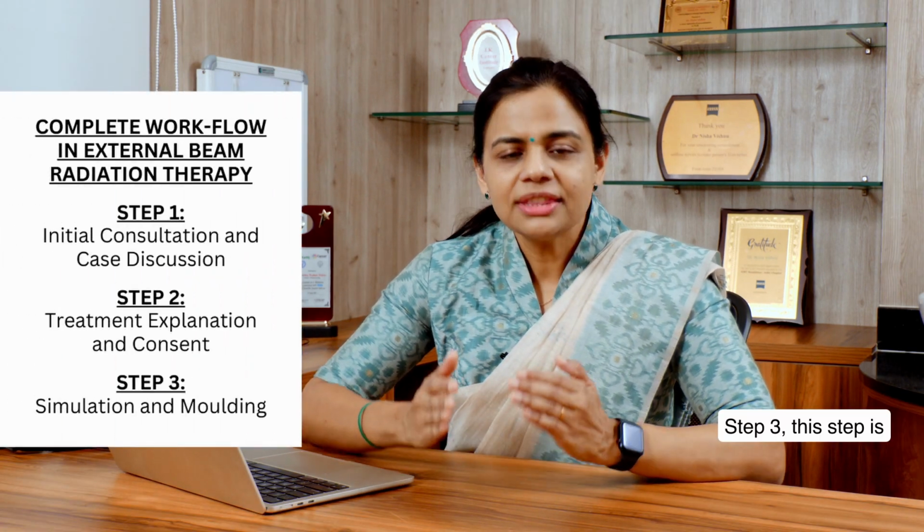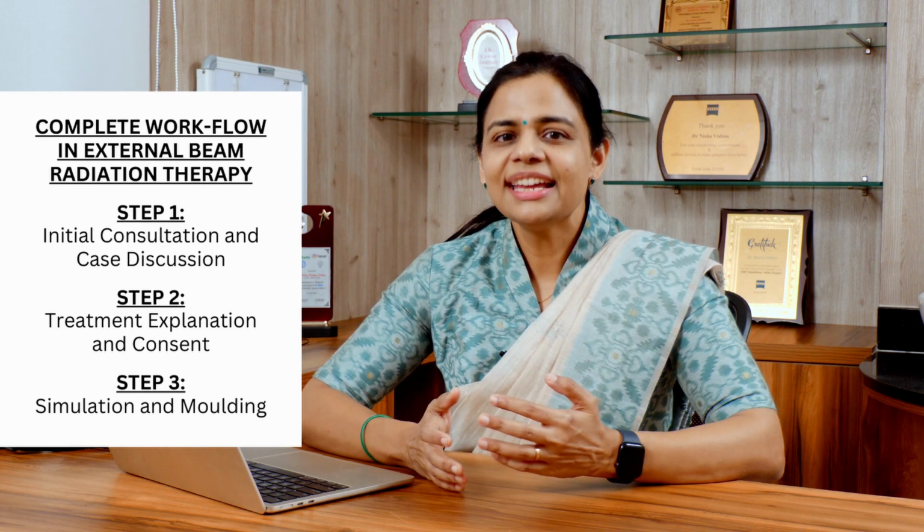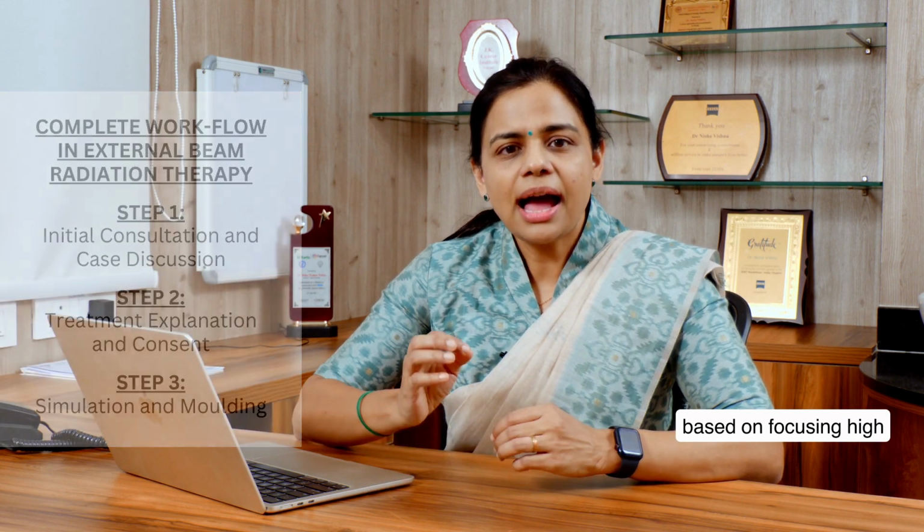Step 3, this step is known as simulation. Why simulation? Radiotherapy is a treatment that is based on focusing high energy X-rays into the areas of your body harboring cancer while minimizing the doses to the adjacent normal areas as much as possible using machines known as linear accelerators. Now the machine does not know you as a patient. It only knows the coordinates that are fed into it.